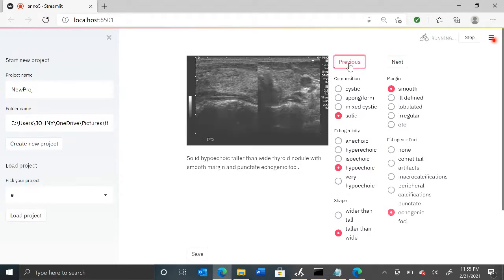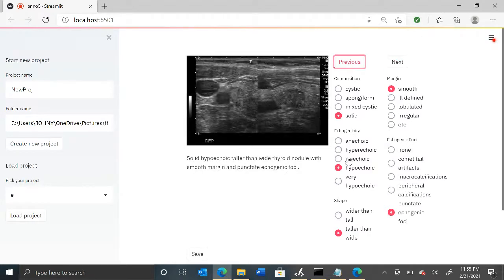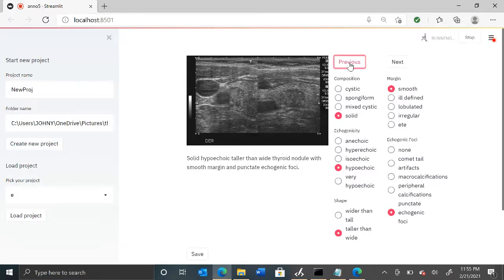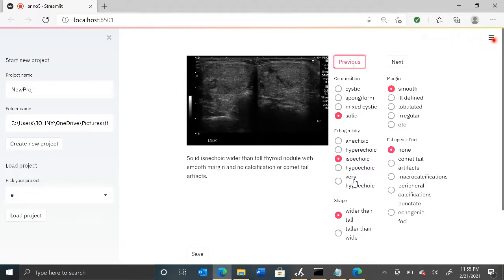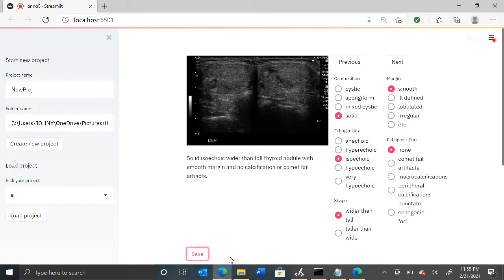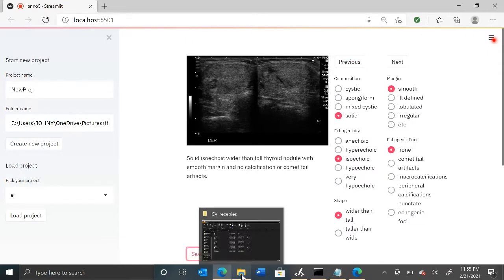Let's see if we go back whether we can pick up the previous annotations. Yeah, it came back as hypoechoic, taller than wider. The first one was wider than tall — let's go back to that. See, it automatically changed it.